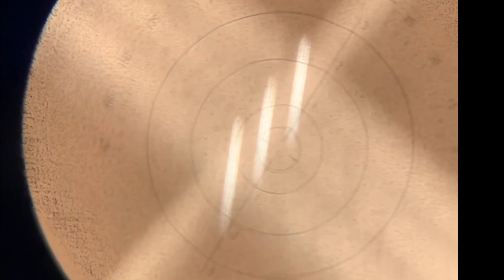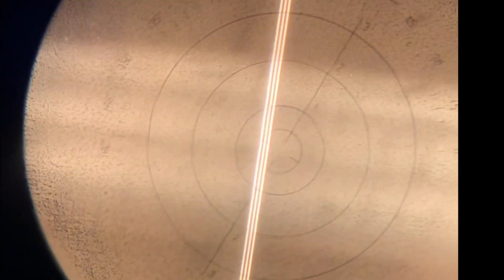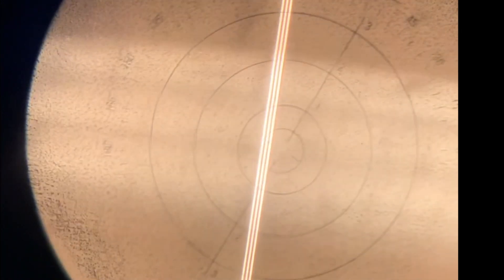To ensure we are reading a lens in plus cylinder, we want to find our sphere lines first and then add power to find our cylinder lines. This ensures we are reading the lens in plus cylinder.